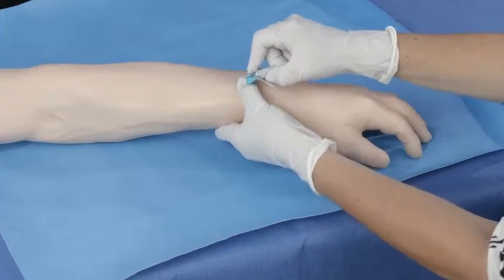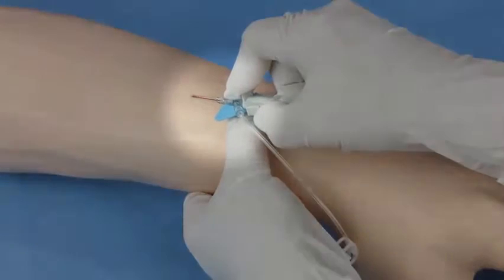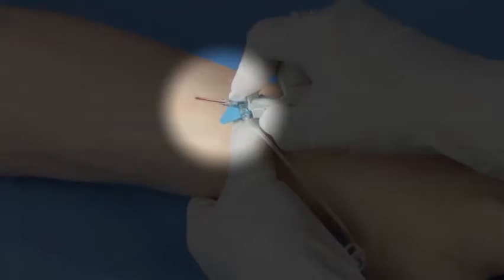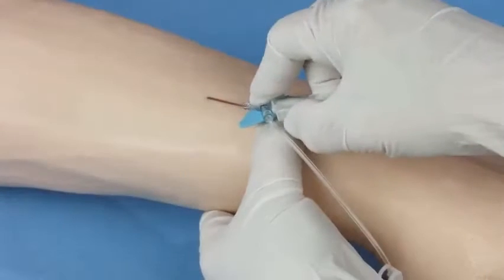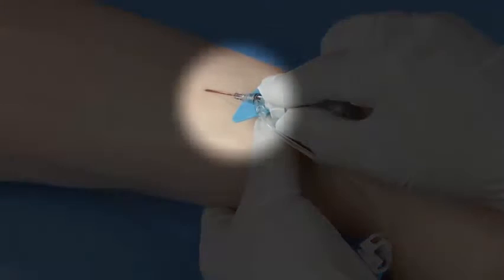Stabilize the vessel and perform the cannulation. Blood is seen immediately in the catheter tubing once the needle penetrates the vessel. Lower the entire system and advance it slightly to ensure the catheter tip and not just the needle tip is within the vessel.